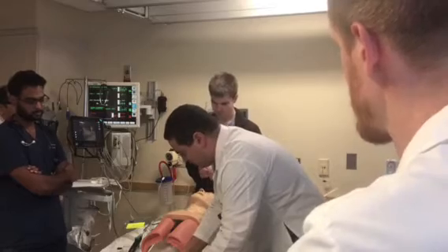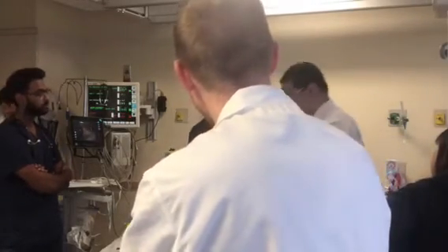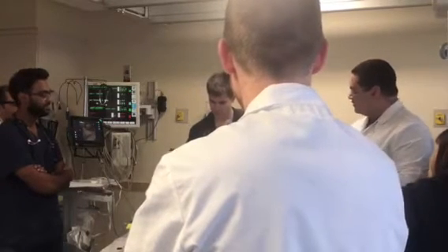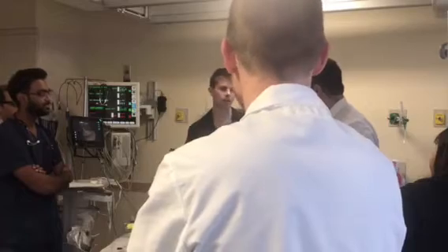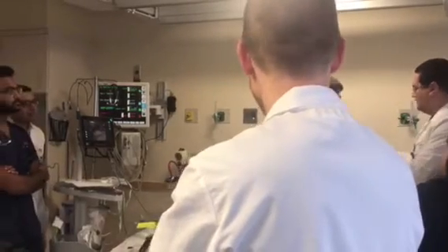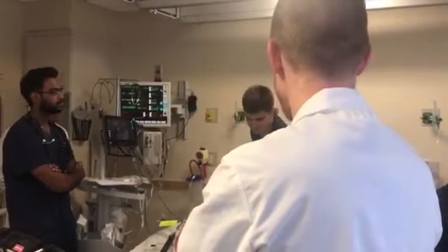So there's a mistake here. Anybody wants to tell him? He's doing something wrong now. You can never do this from above. You have to do it from the other side. Okay. Actually, sorry. I'm mistaken. No, you can do it from above. You can't do it from the other side. It's the opposite. All right, so you're doing it.